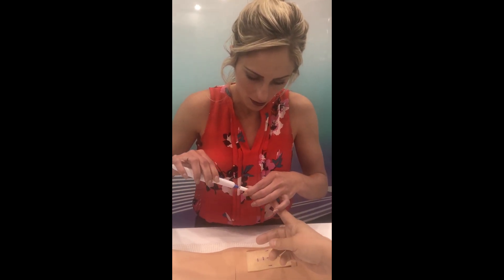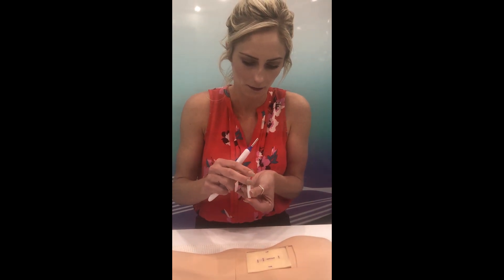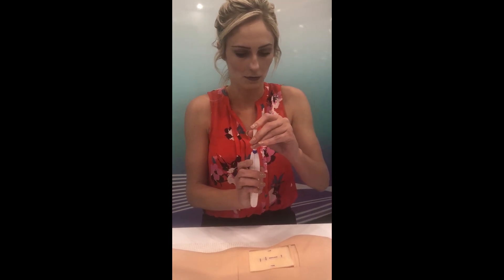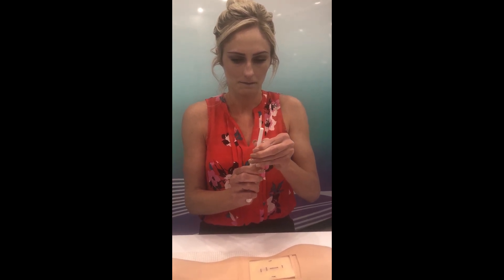Make sure your hand's on the end of it when you do it so it doesn't pop up. Right here. There you go. Nice. Do straight up. So we'll slide the thing forward. There you go. Is it covered? And now go ahead and pinch again and pull up the actual thing. There you go. Is it there? Okay, I see it. Now go ahead and insert it.